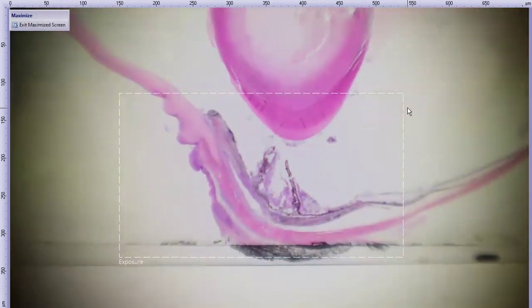From low magnification, we can already see that there's too much purple on the surface of the uveal tract here. Lots and lots of cells. If we look around in this eye, we can also see little bits of purple here and there in the vitreal space. Let's take a closer look.